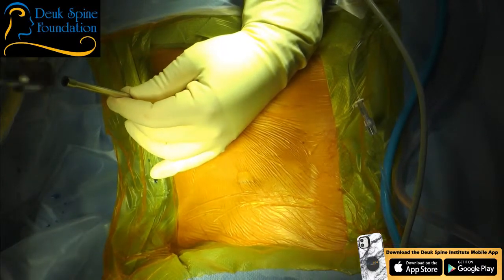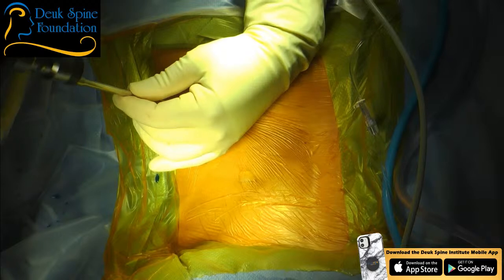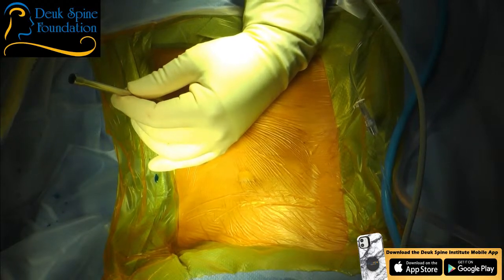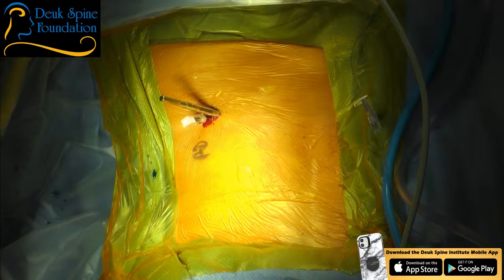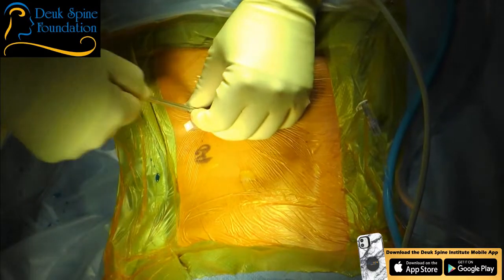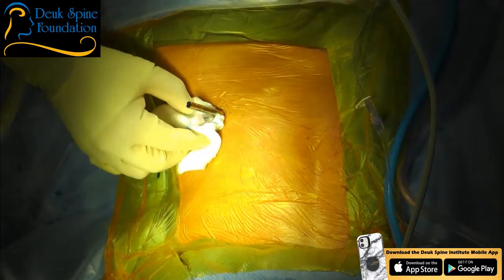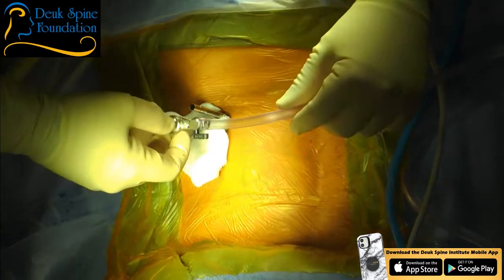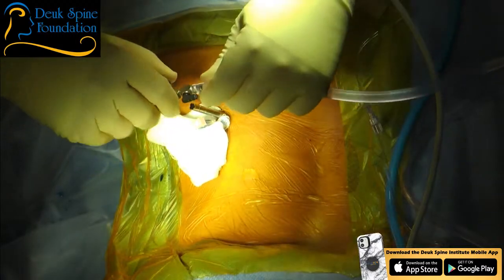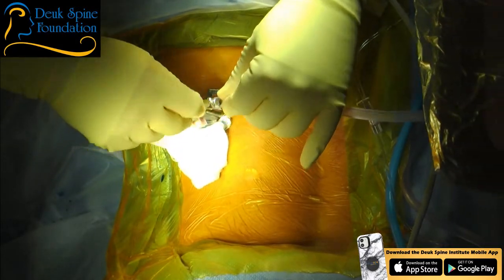And of course, at the level of the spine, I'm not taking any bone out. We're not doing a laminectomy. We're not doing a foraminotomy. We're not taking the bone or joints out like other surgeons do. Every other surgeon that operates on the spine takes out the bones and ligaments of your spine, which you don't want done because it's going to weaken the spine. This transforaminal type surgery, you go through the foramen so there's no removal of any bones or ligaments.